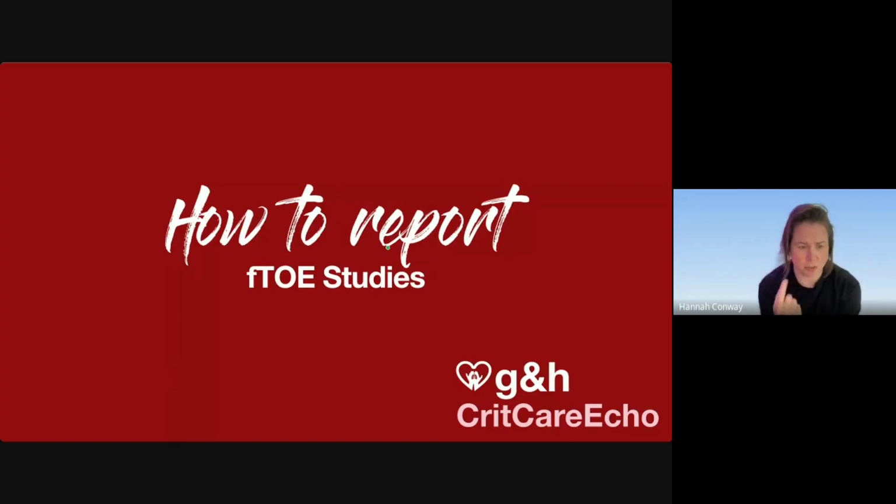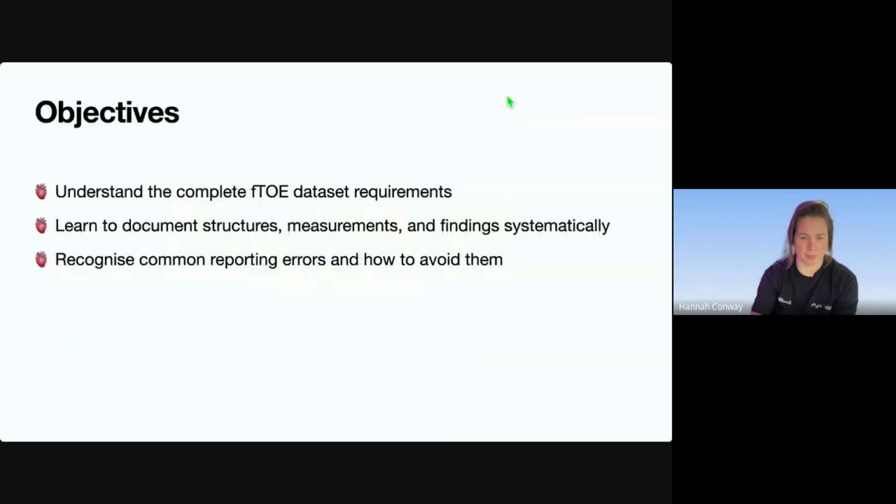So I thought it'd be actually quite interesting to do a quick overview of the actual data set, so that if you're on the edge about whether or not focused TOE would be something you'd want to do, this could hopefully convince you that it's a worthy modality to pick up, if you're in an area that you think focused TOE would be available to you. So without further ado, let's go through the slides.